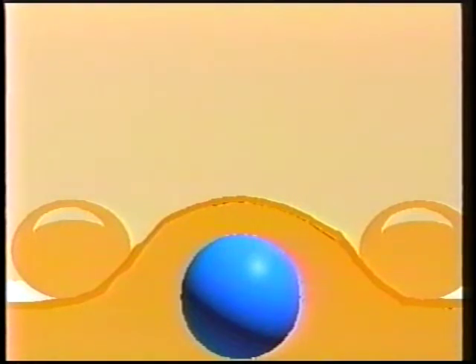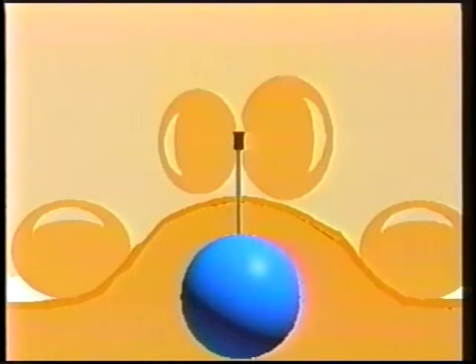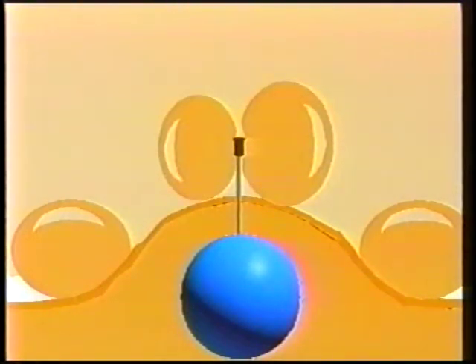Part of the reason for this is that when using only the needle, it is possible to discern even slight differences in consistency as the needle advances. This helps in assuring that the needle is in the correct place, since most targets will have increased consistency compared to the surrounding tissue, which is usually subcutaneous fat.